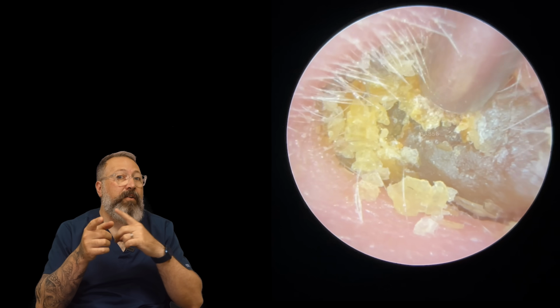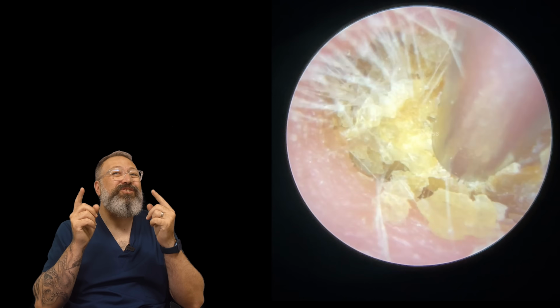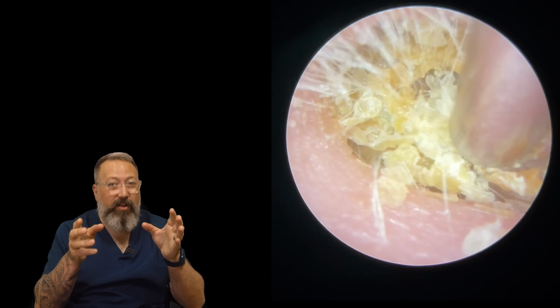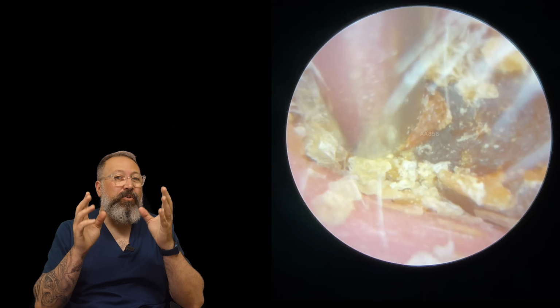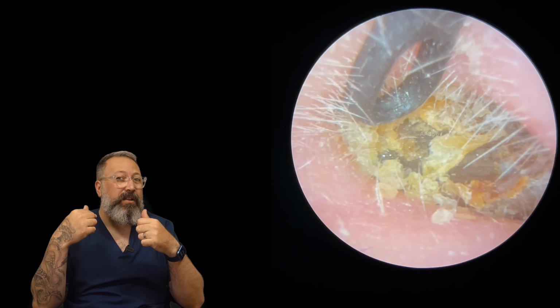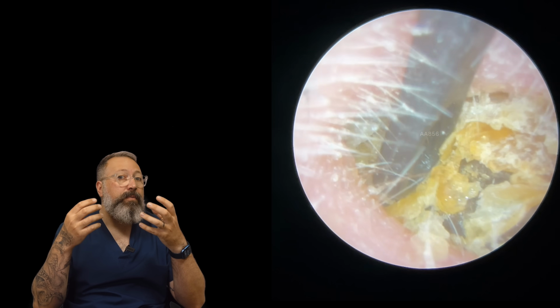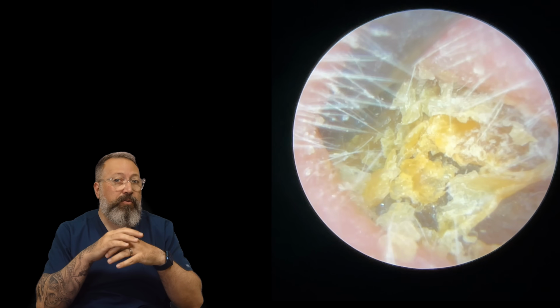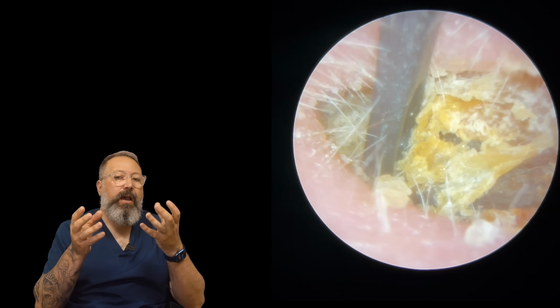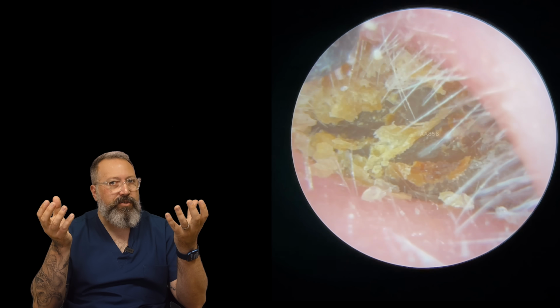Now, I said very different. Look at this. This is mostly wax, and it is solid as a rock. Now, I don't know whether the patient had oiled one side or not the other. Lots of patients do that because when you put oil in your ear canals, for the first couple of days, you do feel more blocked up for a couple of different reasons. The oil will sit around the gaps in the wax, blocking those up. It'll also cause the wax to expand slightly, which also causes a few issues.